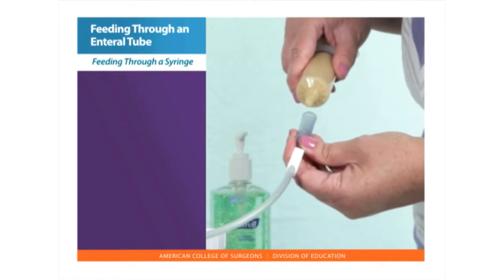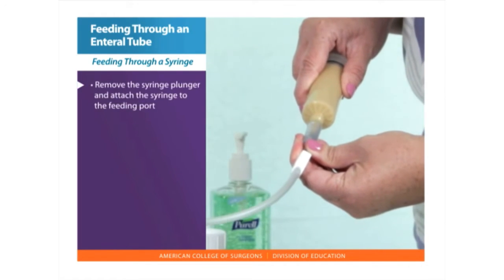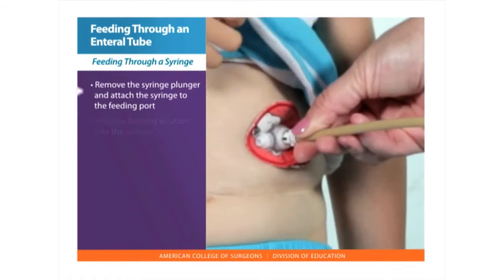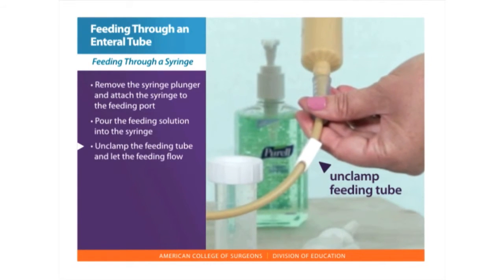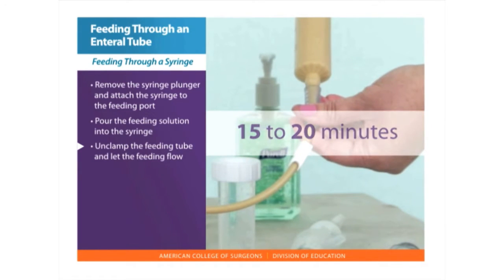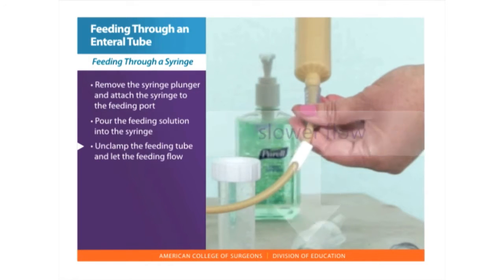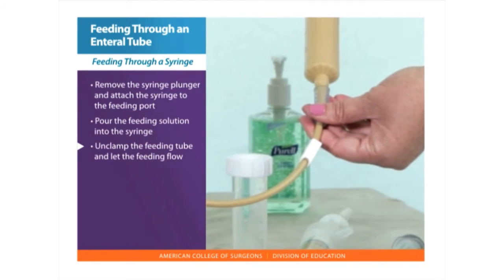Feeding directly through a syringe with gravity. To feed through a syringe, remove the syringe plunger and attach the syringe to the feeding port. Pour the feeding solution into the syringe. Unclamp the feeding tube and let the feeding flow through the tube. The feeding normally goes in over 15 to 20 minutes. Lifting the tube higher results in a faster flow and lowering the tube results in a slower flow.